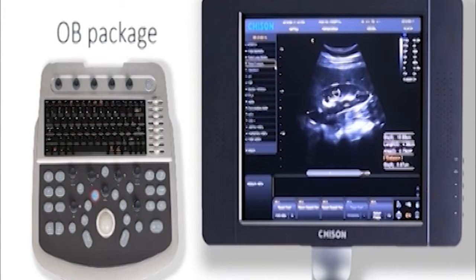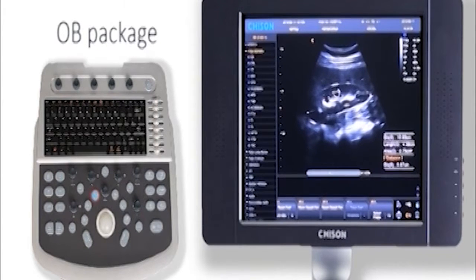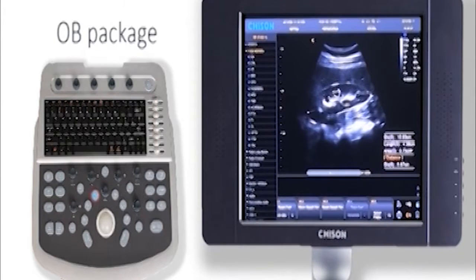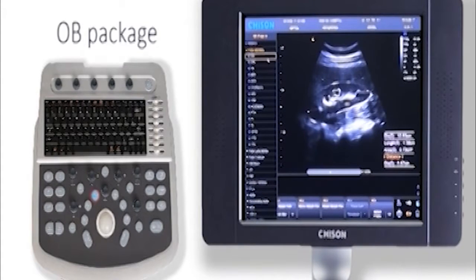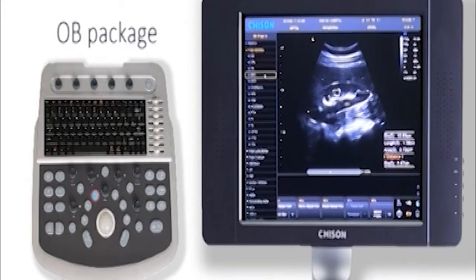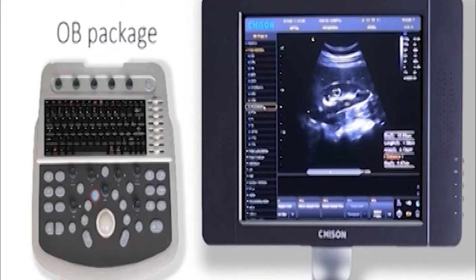For OB package, click the biometry item: GS, BPD, HC, AC, FL. Choose anyone you want. It will give you more information like gestational age and EDD.